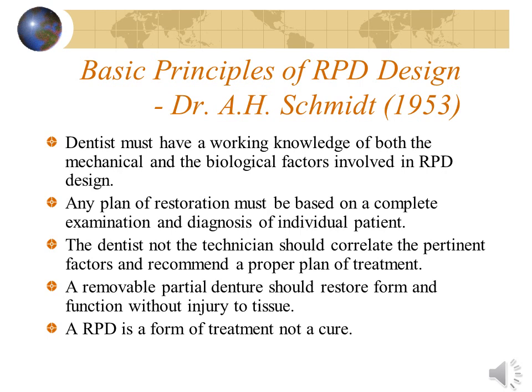Fourth, a removable partial denture should restore form and function without injury to the remaining oral structures. It should produce adequate aesthetics and function without compromising on the health of the soft tissues. Fifth, a removable partial denture is a form of treatment, not a cure. Even after insertion, the patient should be recalled and reviewed to ensure success of the treatment.